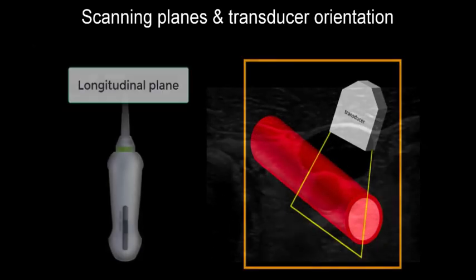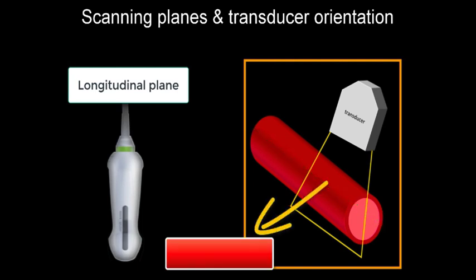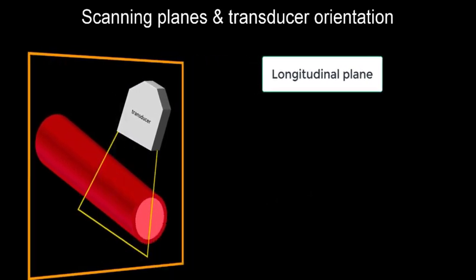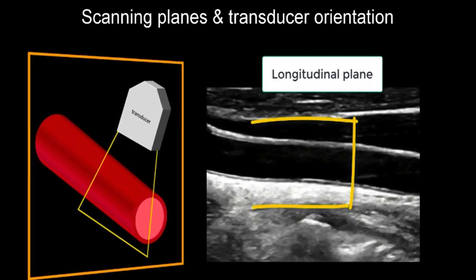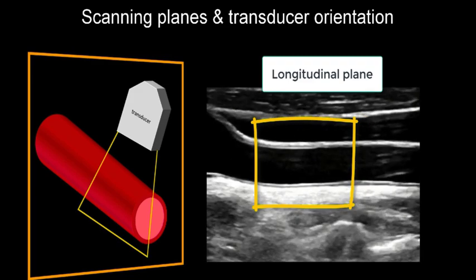In the longitudinal view, we have the transducer parallel to the surface of the blood vessel, and the image that we will obtain is the one of a rectangular shape. As shown in this ultrasound video, we can see a longitudinal view of the common carotid artery.